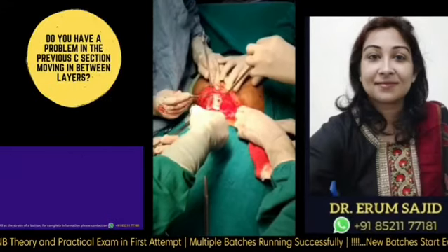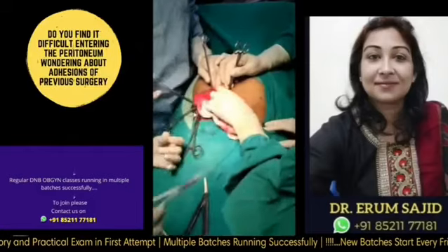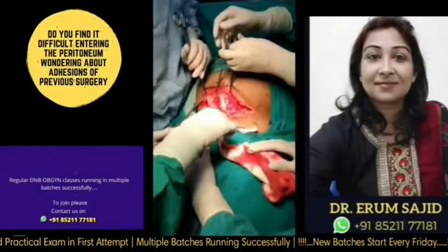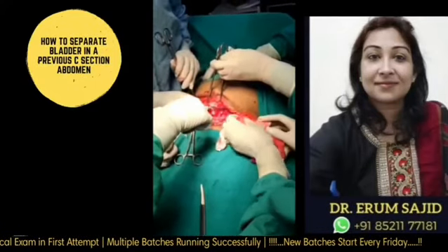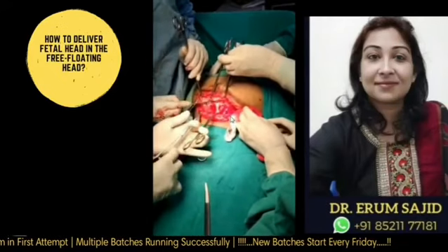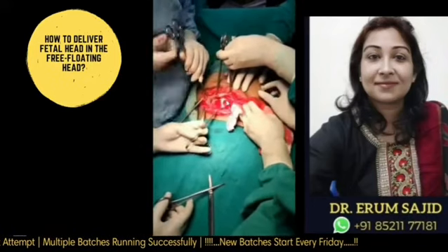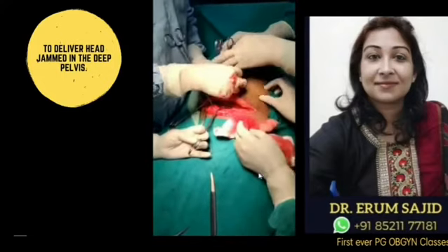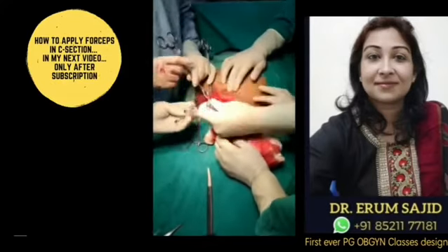I'm scared over here for any perforators, for any oozers, for any muscle belly giving way, because muscle bleed is very bad. It doesn't quieten down with cautery, doesn't respond well to pressure. It just listens by unnecessary sutures, so you keep giving sutures then. Again, very gentle movement of the scalpel. Also be very careful while putting the knife back, because all your assistants are busy helping you and you are putting the knife right at a place where they are working and they're using their hands.